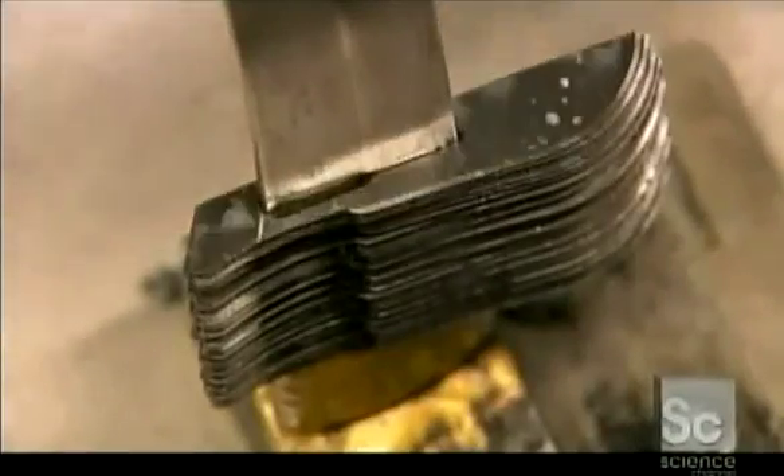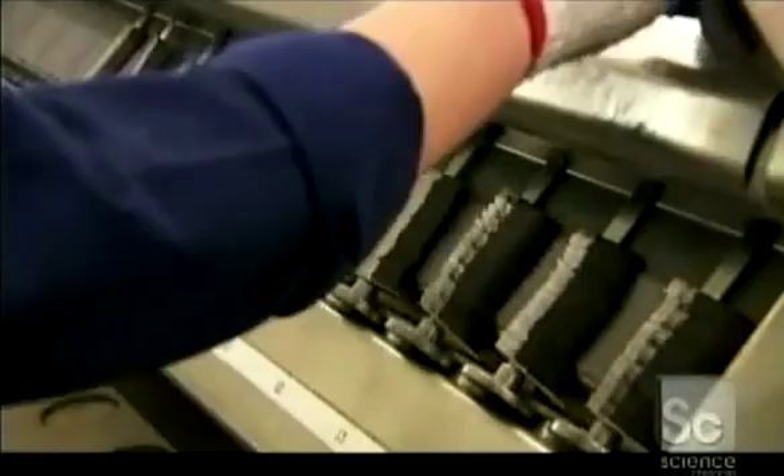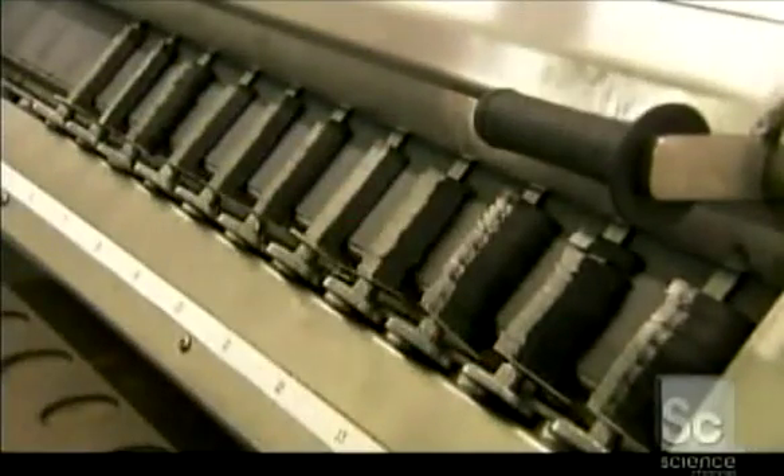As the blades come off the grinder, they cling together, because the magnet that fed them into the machine magnetized them. To cancel this effect, a demagnetizing machine passes an electromagnet behind the stacks of blades.